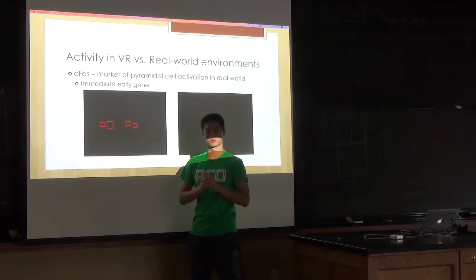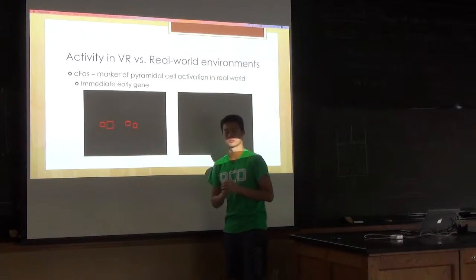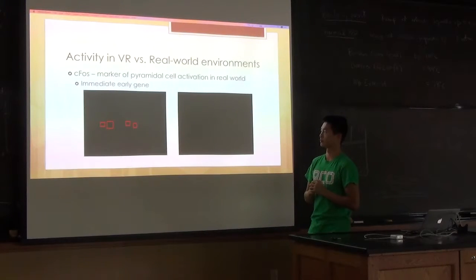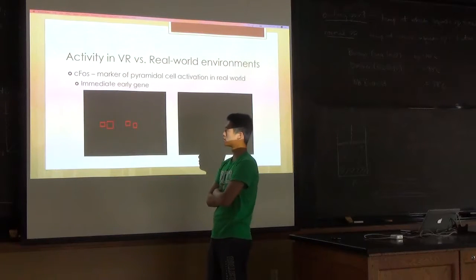So to me that looks like a fluorescent staining. That's not fluorescence? No. Okay, so you use DAB as the substrate? Yeah. And essentially all the cells are activated there? Yeah, the darker cells. So it's activated everywhere. I mean, there are a few. To me, when I'm looking at that, I actually initially thought it was a fluorescence slide, and I thought the white was the staining.